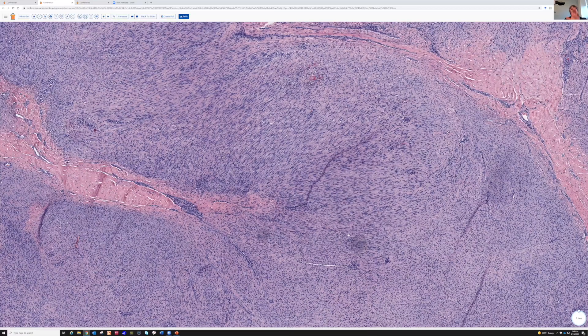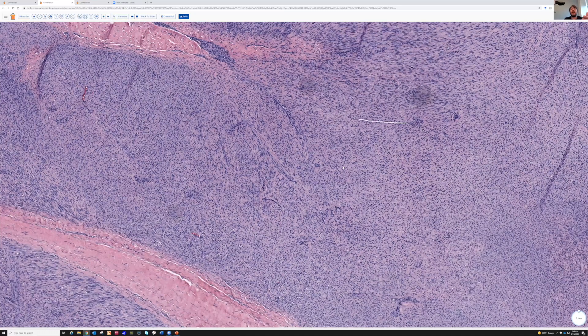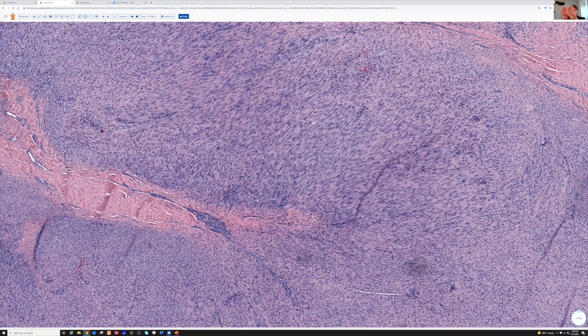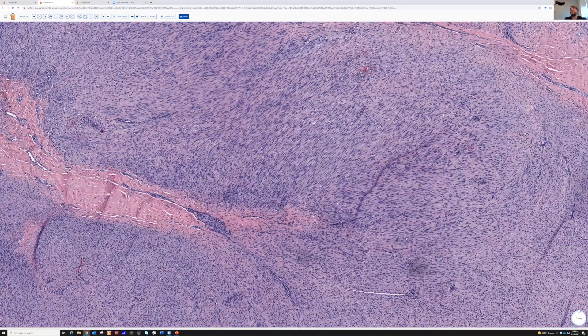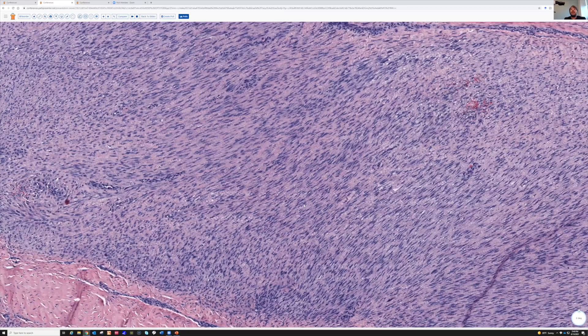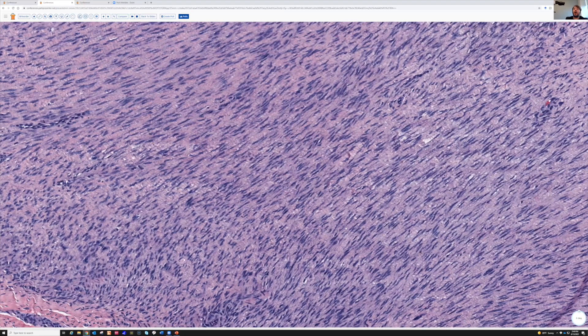Synovial sarcoma sometimes can have areas like this, but usually the cells are very closely packed together in some areas of the tumor. You can usually find an area where the fascicles are very densely packed and the cells are crushed right up against each other. So the separation of the cells by collagen in between, and the way they're all running together in very broad fascicles in the same direction — all of that's helpful.